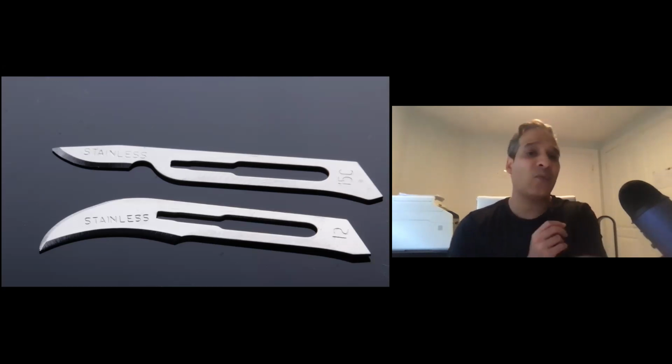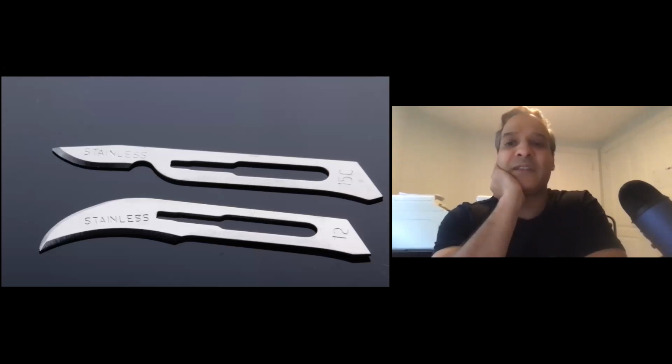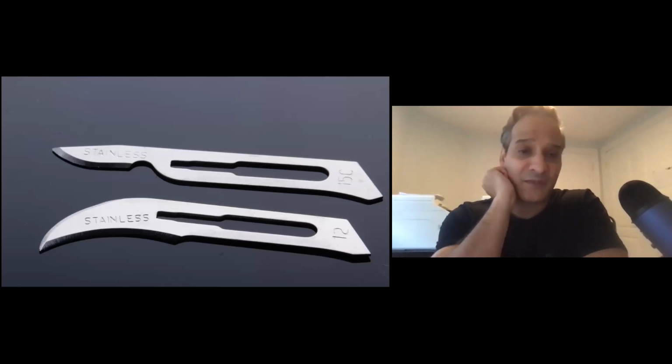Blades-wise, for grafting, I use a 15C, a 15 blade. For harvesting grafts, I like to use a 15 blade.